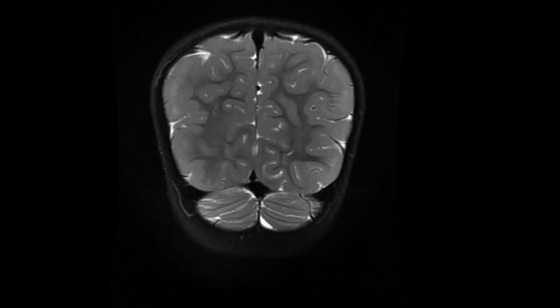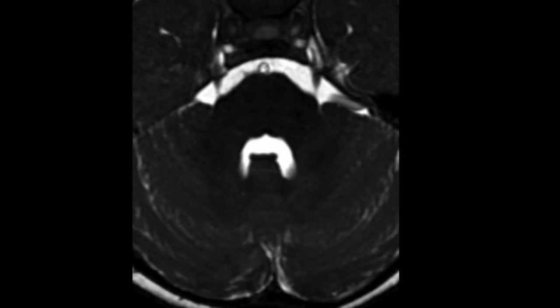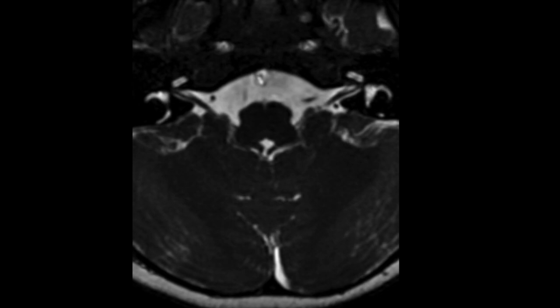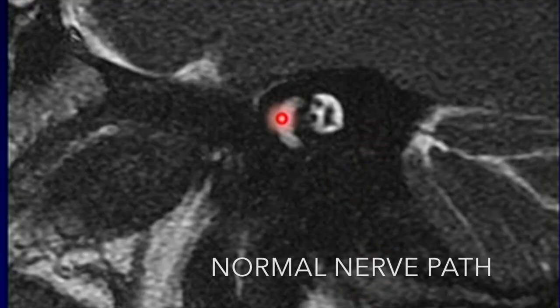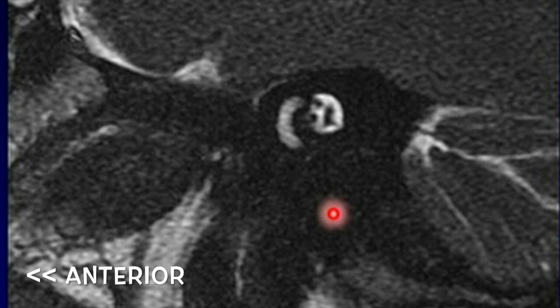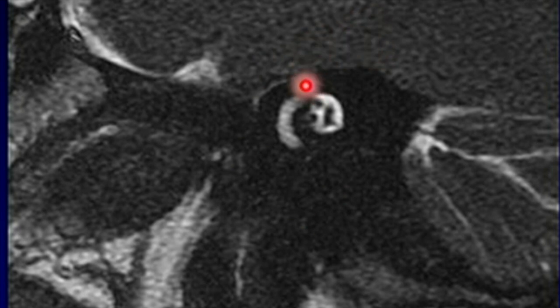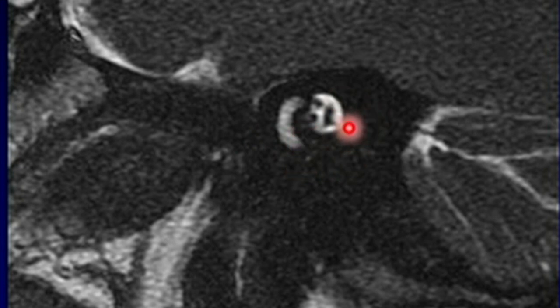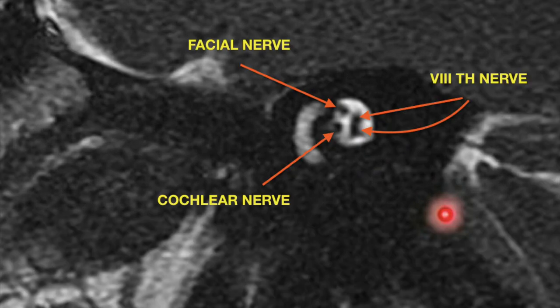We also acquired 3D gradient echo sequences to look for the 7th nerve. The 7th and 8th nerves accompany each other in the cistern as well as the internal auditory canal. These are seen as Bill's bars within the internal auditory canal, wherein the facial nerve is located anterior superiorly, the cochlear nerve is located anterior inferiorly, and the superior and inferior vestibular nerves are located posterior superiorly and posterior inferiorly respectively.